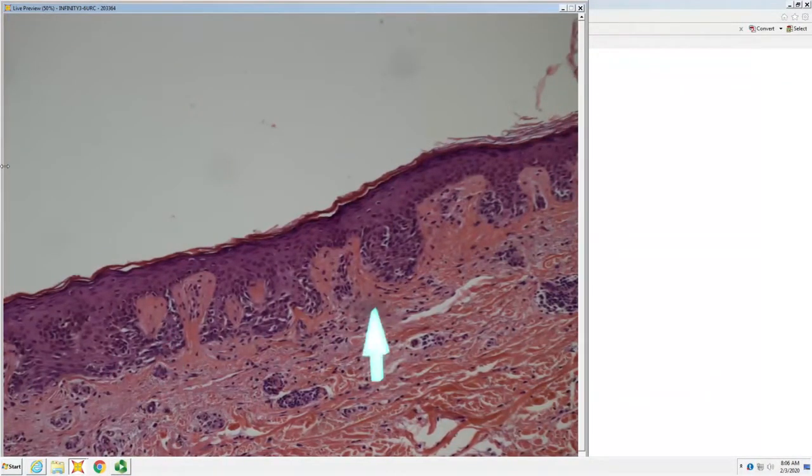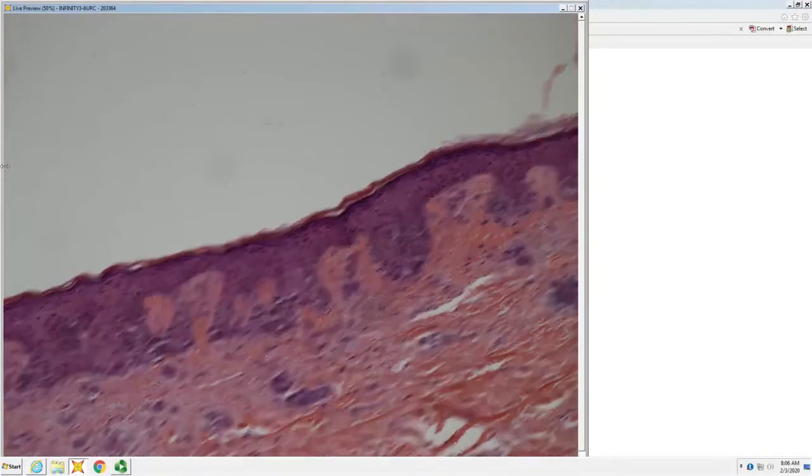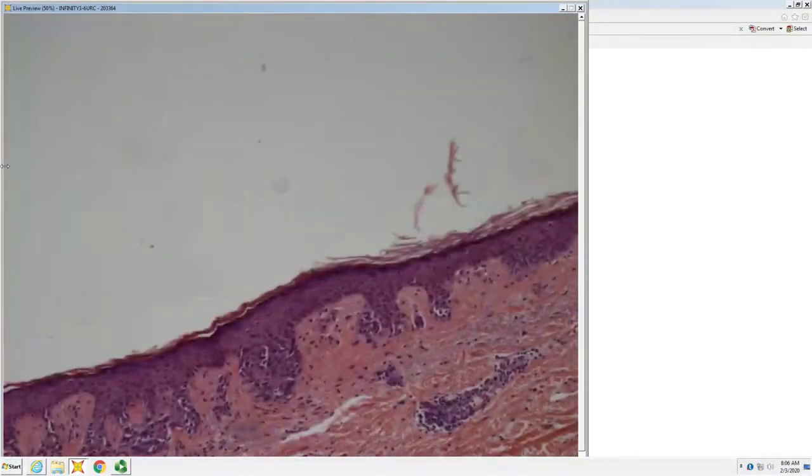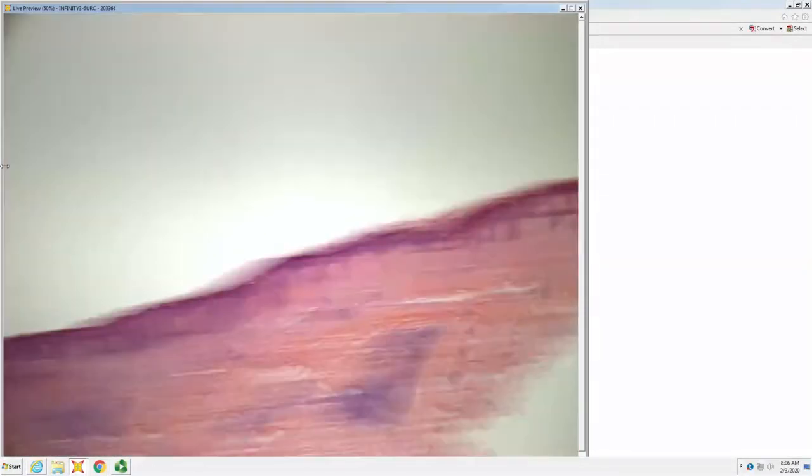And you have these cells at the DE junction. Like a vacuole or... They're actually melanocytes. And are they content to stay at the tips and sides of rete, or are they crawling up into the arches in a poorly nested fashion? The second one. So they're crawling up into the arches. So what is your arch enemy? That's melanoma. Yeah. So that's MIS.